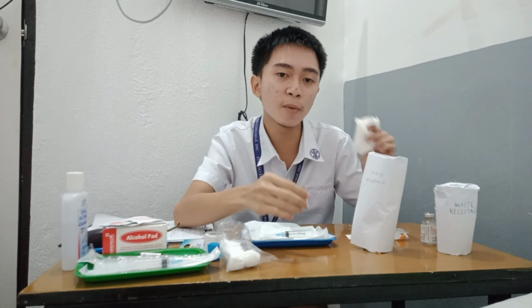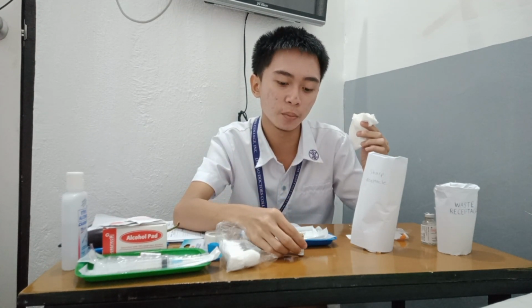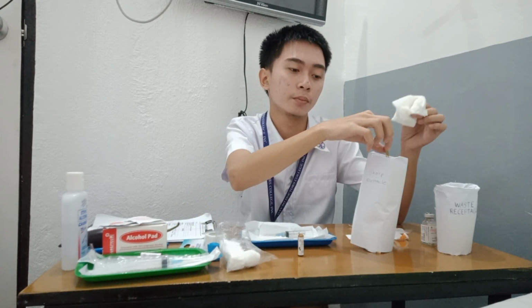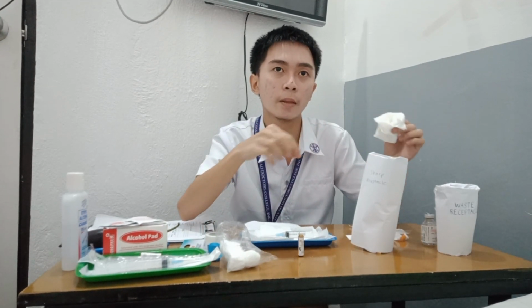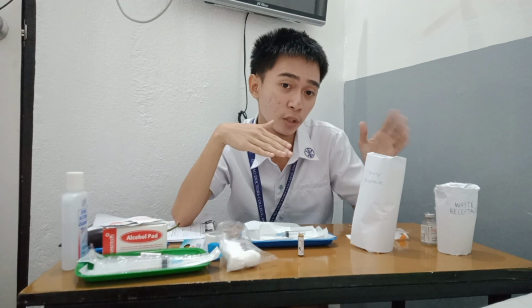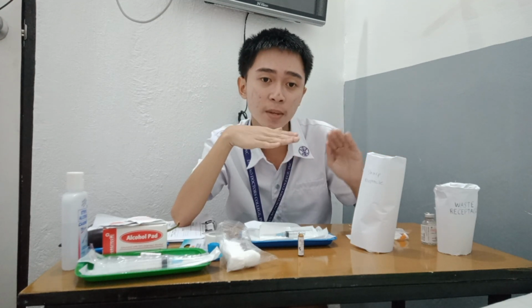And dispose of the top of the ampule into the sharps container. After doing it, we're going to discard the broken neck of the ampule in the sharps container and set it down, and withdraw some medication.